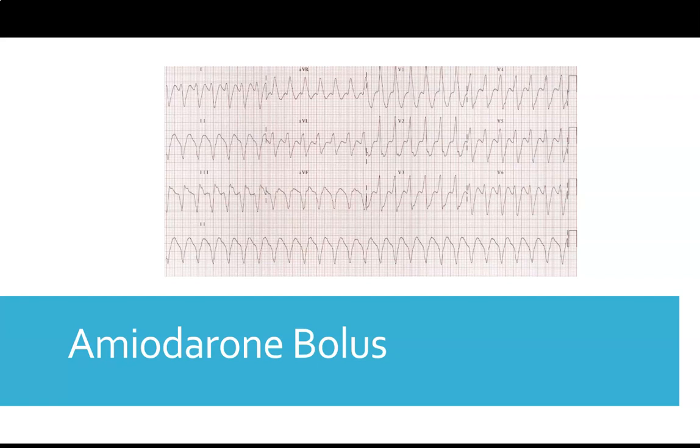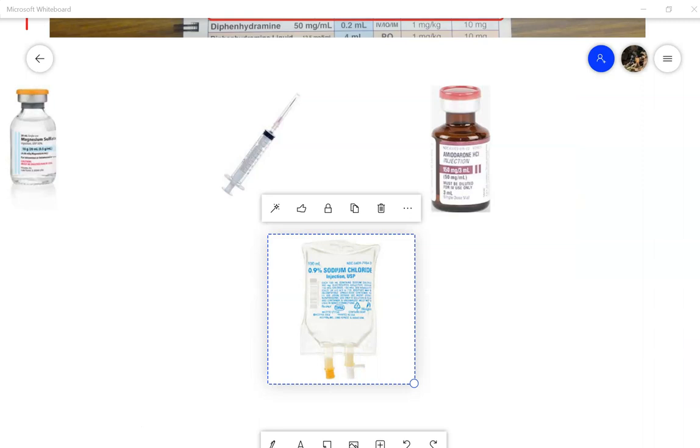Because you're giving a bolus, can you still use the pump? Yes, you certainly can still use the pump. But when we're giving boluses of medication, what mode do we do it in? And that's general mode. So when we're setting this up, this one is a little bit more complicated. When we're giving a medication in general mode as a bolus, we only want to put the quantity of medication in the IV bag that we want to administer to the patient. So we never want to put more volume in the bag than we plan to administer if we're using general mode, if we're using a bolus.